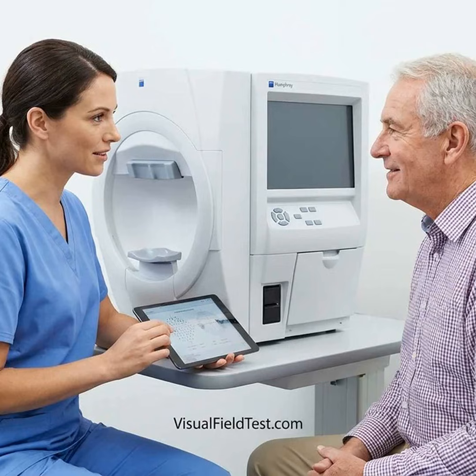Do not change glaucoma treatment or other medicines based only on a home application result. The first several home tests may reflect learning rather than true change. Clinicians should review trends over time instead of reacting to one isolated home result.